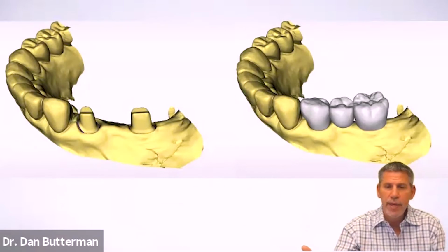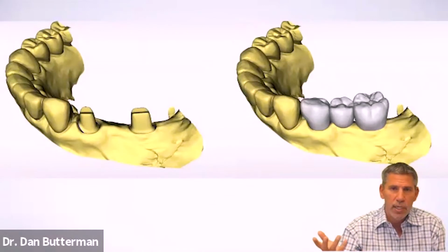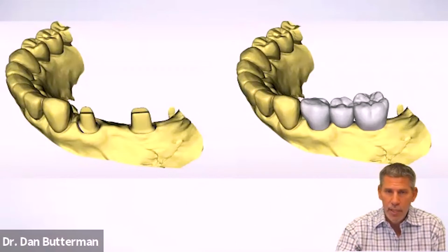I don't actually have to do that. These abutments have been virtually placed into the patient's mouth, and it's to the right depth, the right contour of the tissue, because we just imaged this a short while ago. And now either me or the laboratory is going to have that model, and you can design the bridge. If they're doing traditional techniques in a lab, they can print this out, and they can design this off a printed model. If they're using a digital platform, well, then they can design this digitally and mill it out.